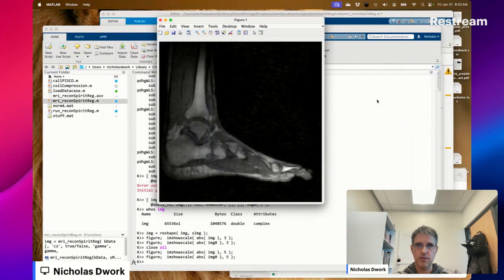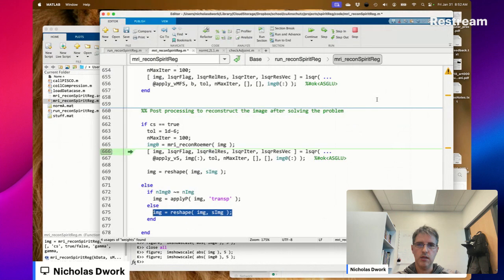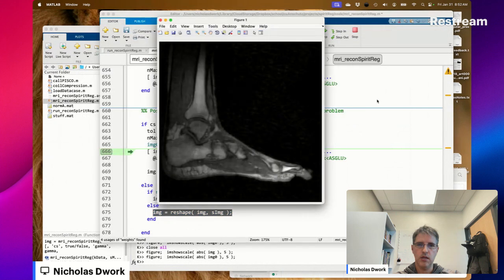There's a subtle difference between the two, but the difference is noticeable. I don't know if you can see it through the compression artifacts of the stream, but compressed sensing is less noisy. That's what I expected. Like you can maybe see it here. Here, I'll show you.